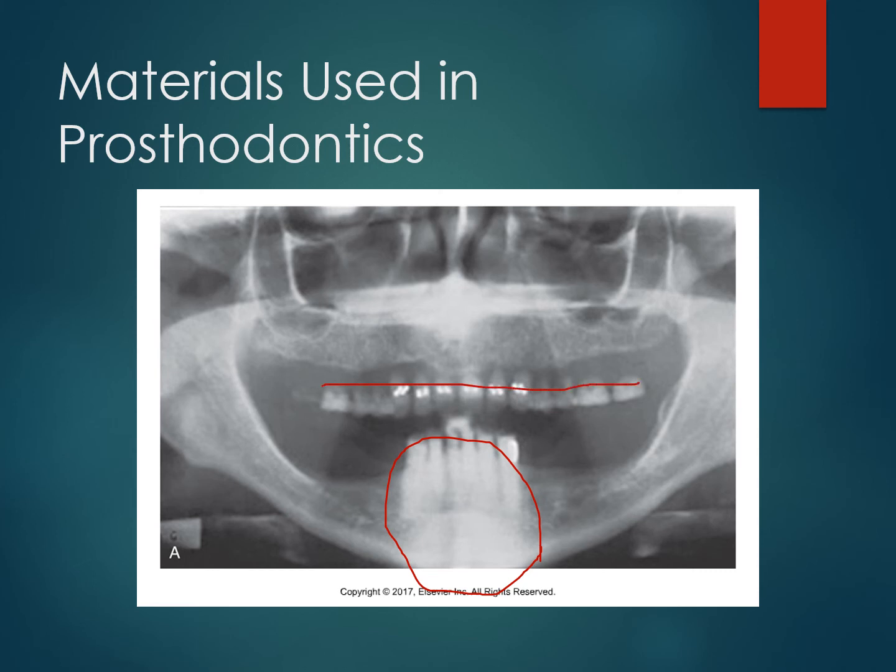Now, sometimes you might have the patient leave this in so that you get that bite, you get the patient into the focal trough better. You're going to hear a lot of people who talk about that and how, sometimes it's a good idea to leave maybe one part of the denture in while you take an image of something else. When you take a panoramic, you need to have them take all of it out, okay? All of it. If you were taking maybe a couple of PAs on these lower anterior teeth here, you might have that patient leave the upper denture in so that when they bite down, they hold the receptor in like they should, but not for a panoramic, okay?